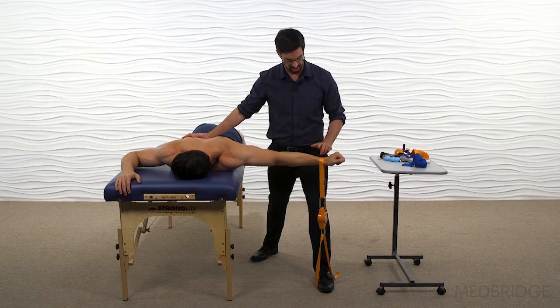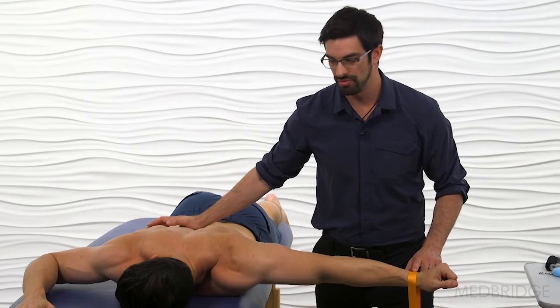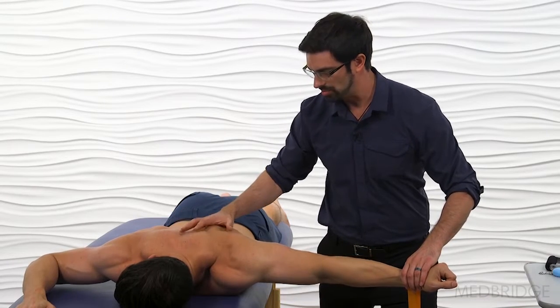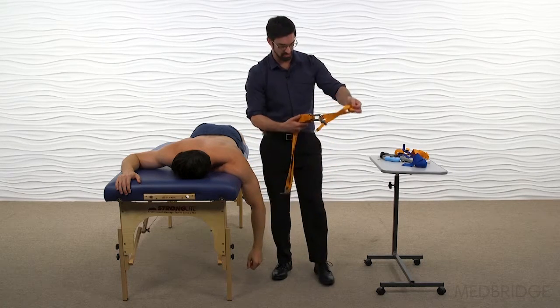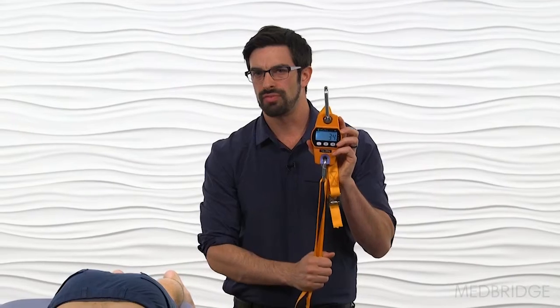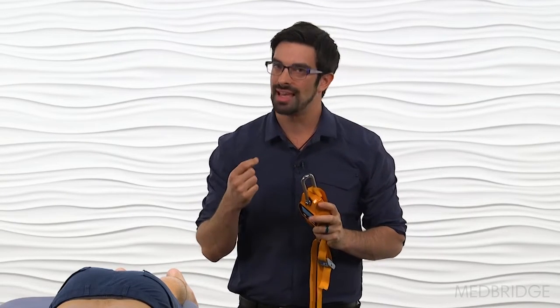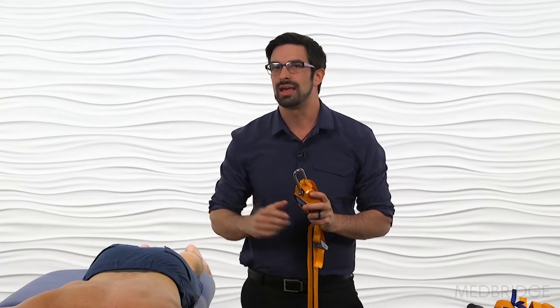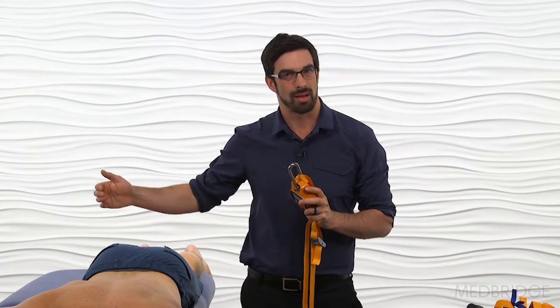Aaron, slowly build up pressure and press up into the strap — 5, 4, 3, 2 — and release. Looking for any compensations from the patient. Pull out the device, and we can now see we have a reading of 3.4 kilograms of force — an exact quantification of Aaron's strength. Easy to do, takes almost less time than a standard manual muscle test. We'll test one side and then compare to the opposite side.